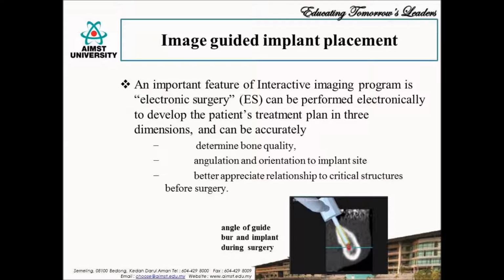Now I shall discuss how image guided implant placement works in actual practice and how it is helpful in implant dentistry. An important feature of interactive imaging software programs is that the clinician and radiologist can perform electronic surgery by selecting and placing arbitrary cylinders that simulate root form implants in the images to develop the patient's treatment plan in 3 dimensions.